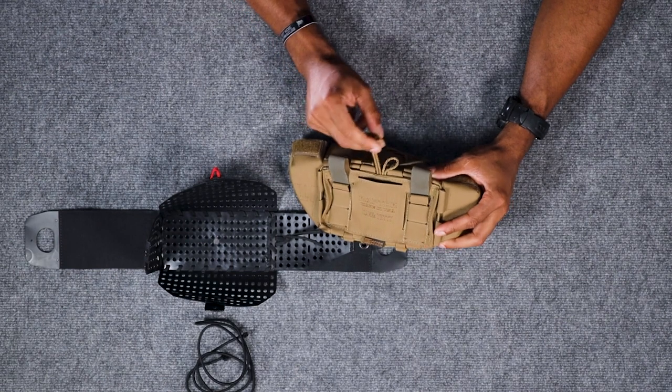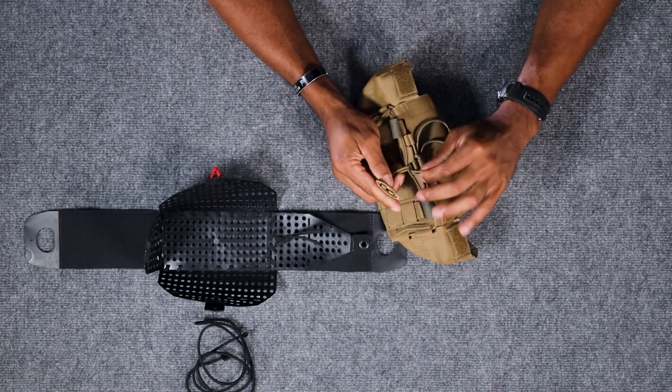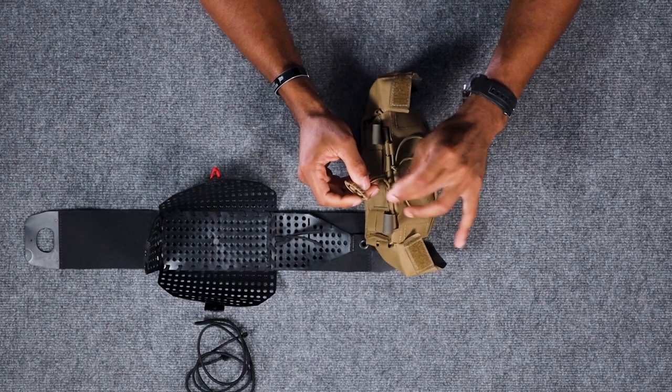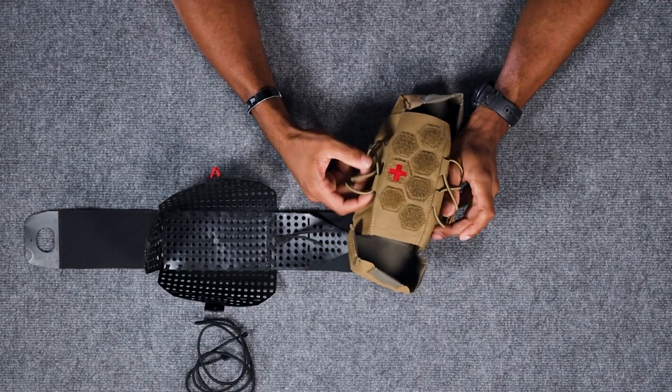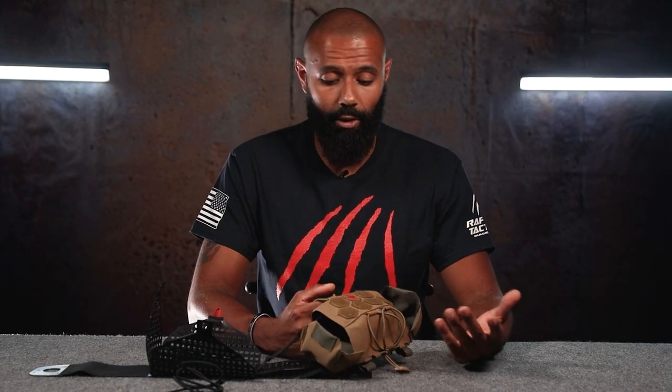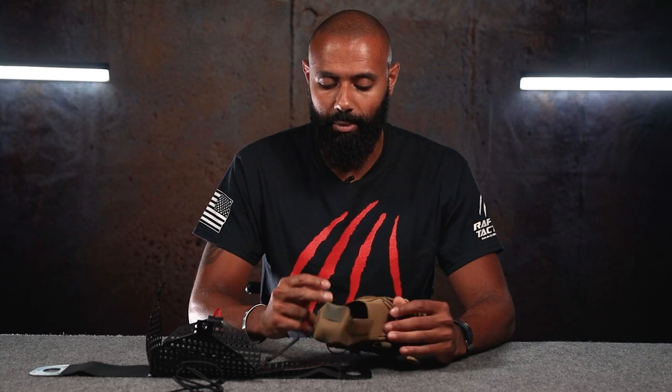Also on the rear here, you have a slot for your trauma shears. Trauma shears will go in there, then the bungee will go over, and then you can secure the bungee with this tab here. Along the top and the bottom, we have these bungees in place also. These are two attachment points, so you can put some extra medical gear in there — personally, I think those would be a good place to put some tourniquets, so you can have those easily and readily accessible.